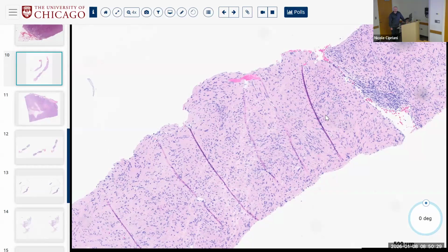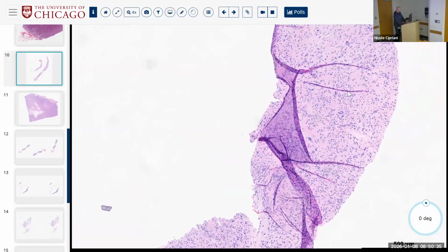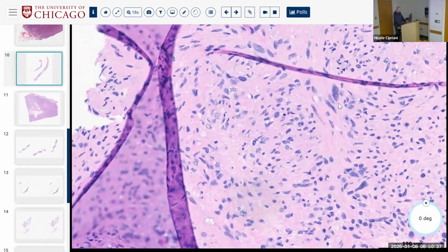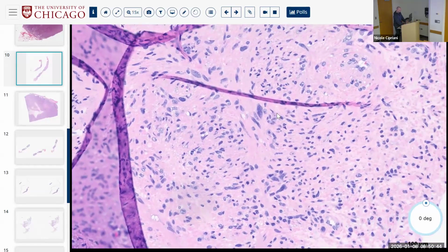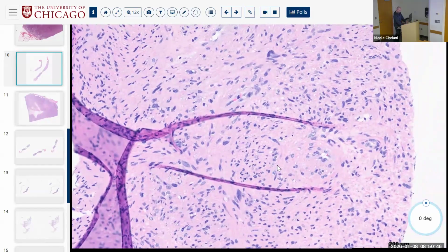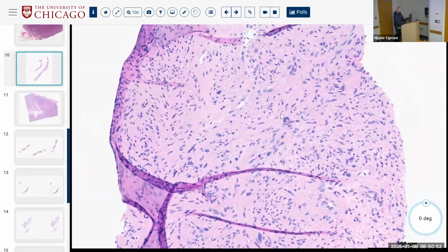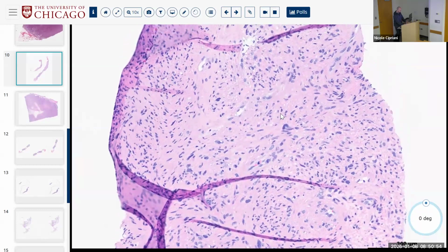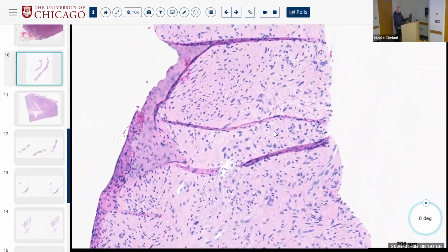Yes. Right. So the subtle nuclear enlargement and hyperchromasia would be a little bit bothersome for a benign perivascular thing. There are these symplastic glomus tumors, right, that can have this bizarre nuclear atypia, but does this have the cellular morphology otherwise of a glomus? Not really, right? It's more spindly myoid. Okay, what else is on anyone's differential, if we're thinking about myoid?